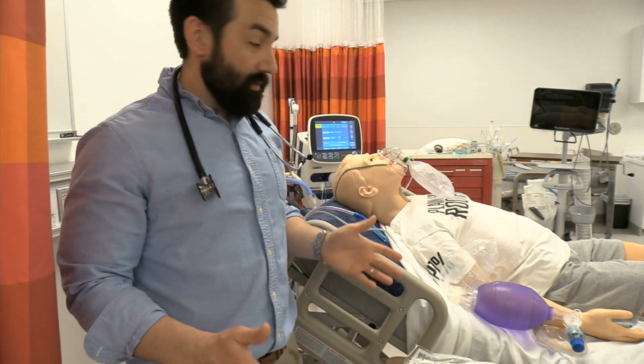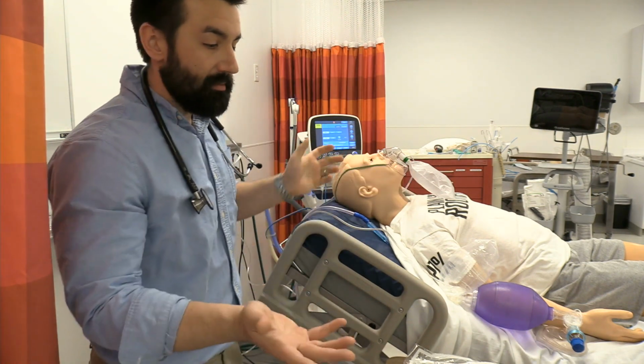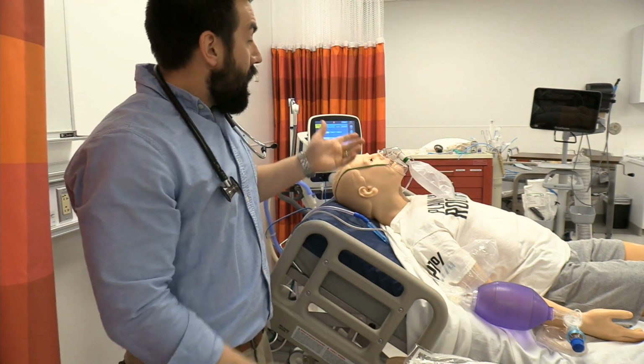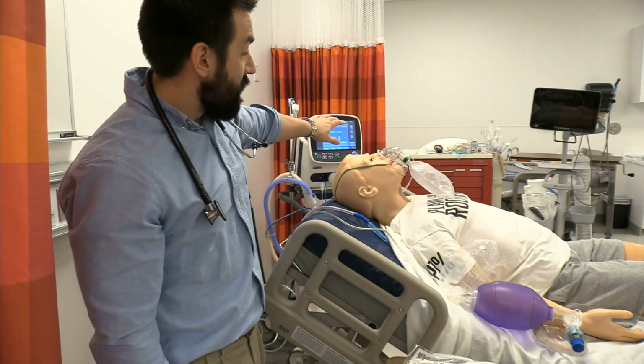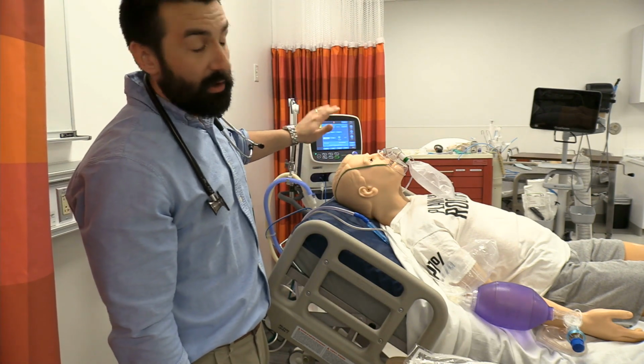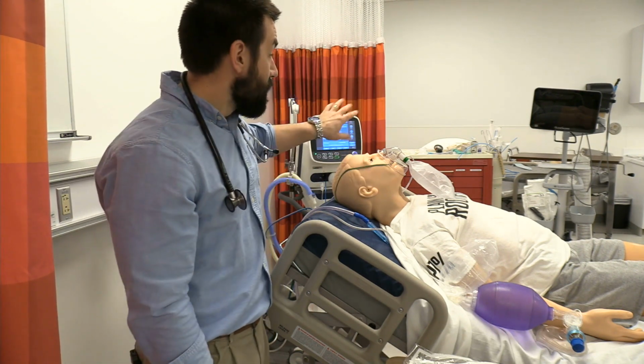I usually set that on the left-hand side there for the physician. All of my stuff, when possible, I set up on the right-hand side. That way I'm not having to reach over them whenever I'm passing them supplies and everything like that. I only have one ET tube set up. I'm not going to waste through a bunch of stuff, but you need to make sure you got appropriate and very quick access to other airways as well as your difficult airway stuff.